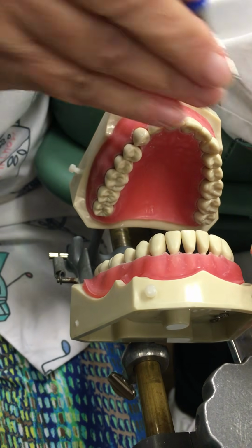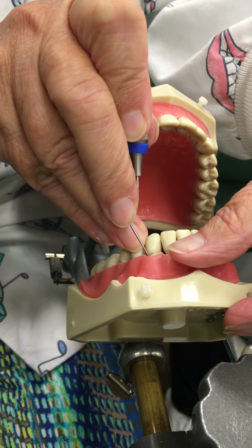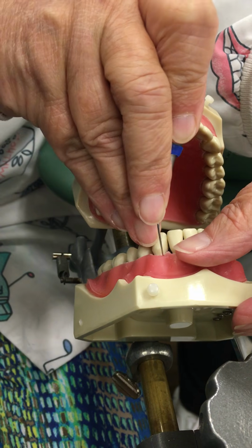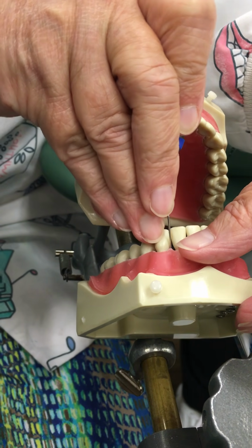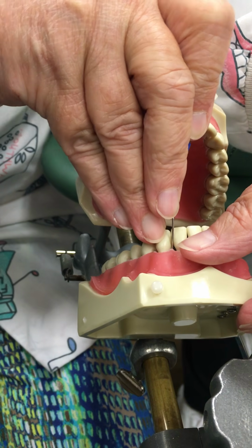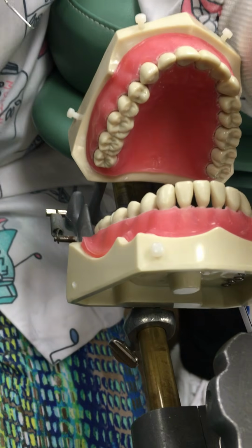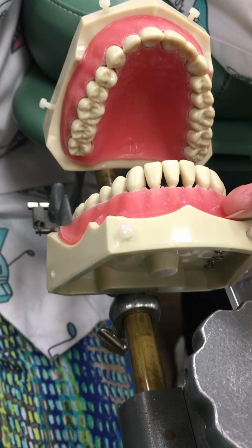And then as we get to this canine, we're in here real close.